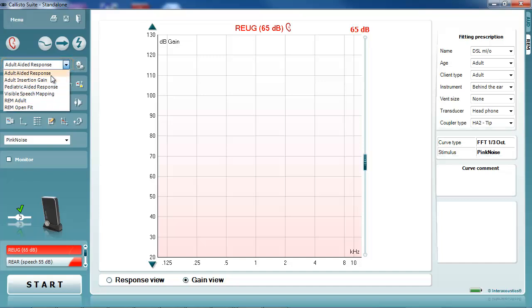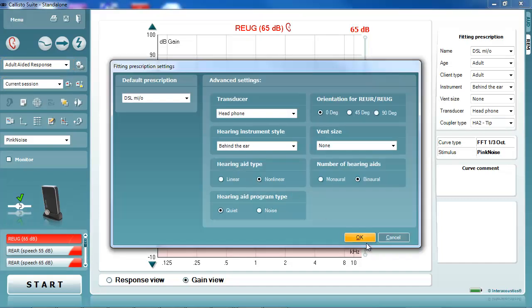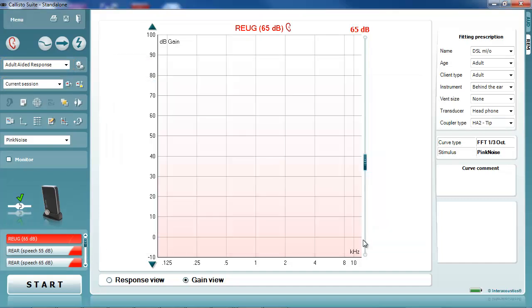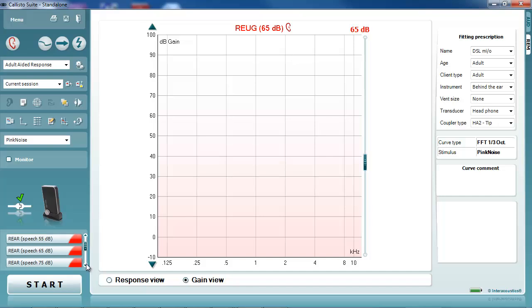The next step is dependent on which real ear measurement protocol you are using. Despite this, the calibrate for open-fit button must be selected before taking any aided measurements, but after performing any unaided measurements.